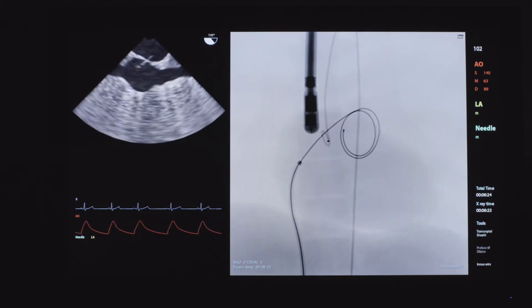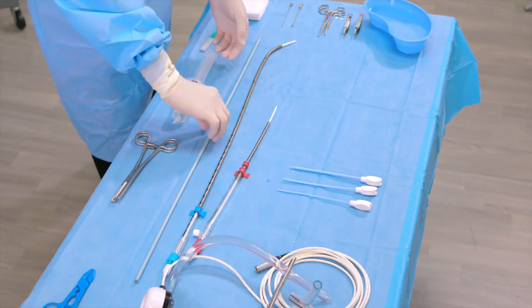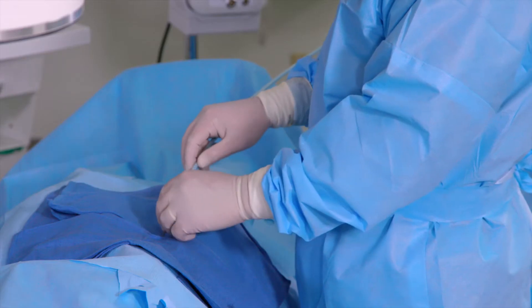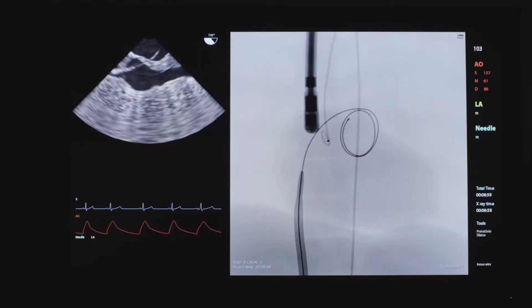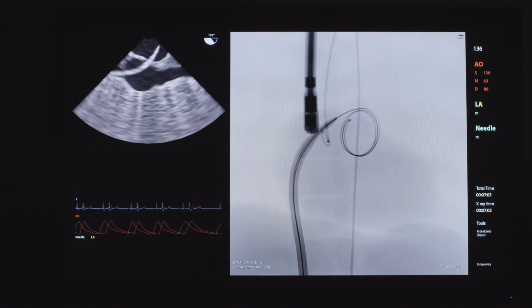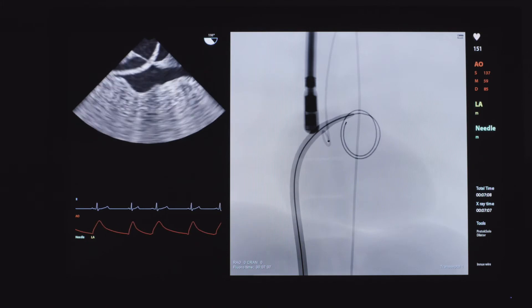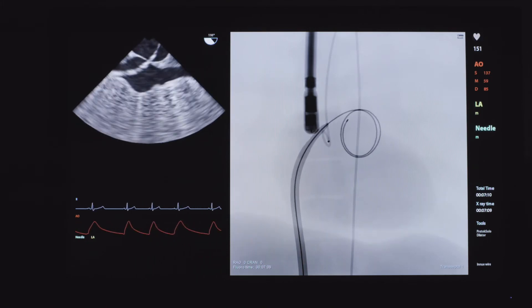Anticoagulate to achieve ACT level over 400 seconds. Advance the two-stage dilator over the guide wire until the largest diameter section enters the left atrium. Then remove the dilator.